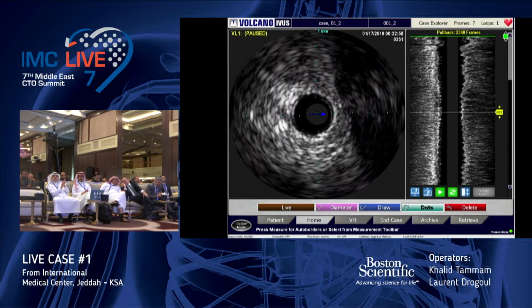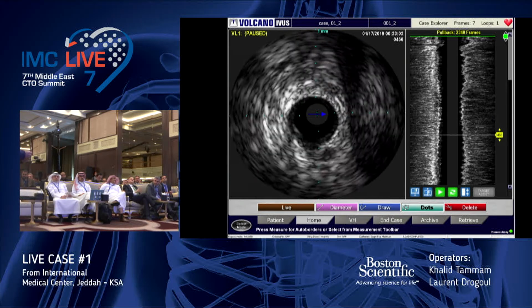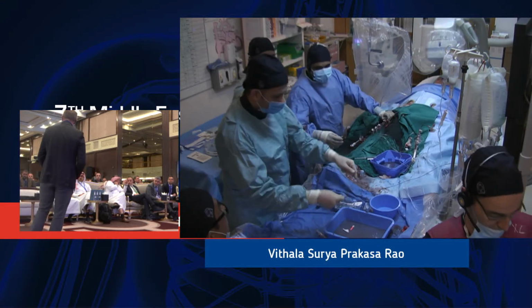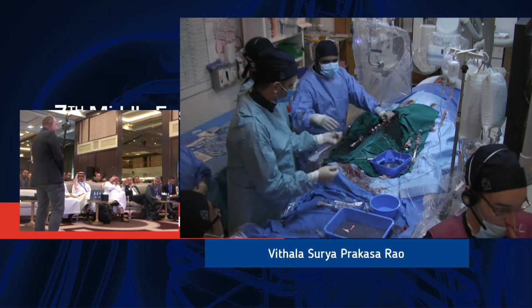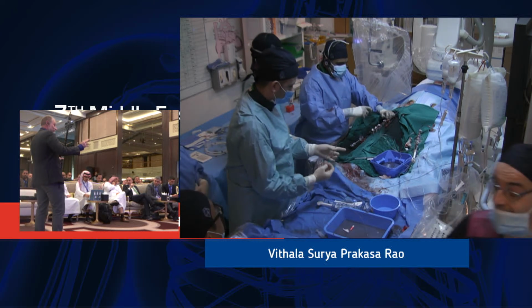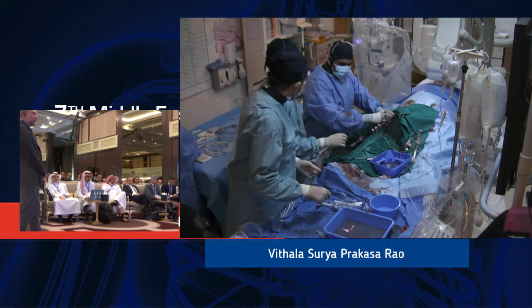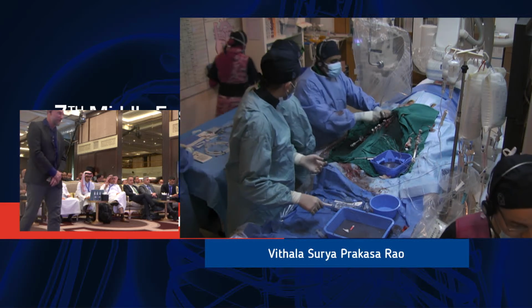Always hard to start the meeting like this. So then we will switch for a second live case from India. So I hope everything will go well. So hello. We check the angle. We check down. Do you hear us?